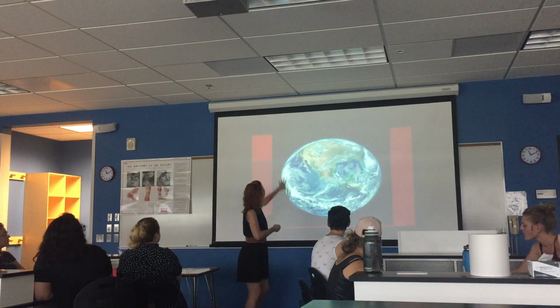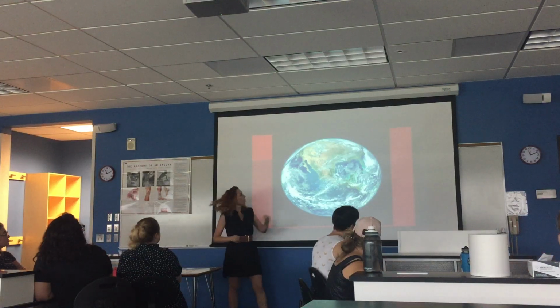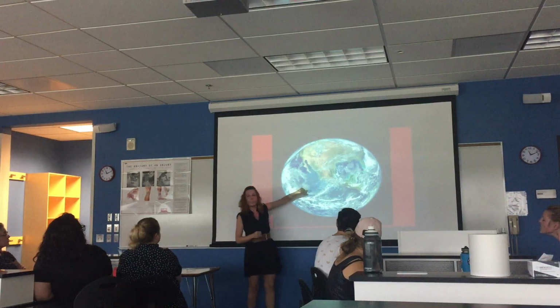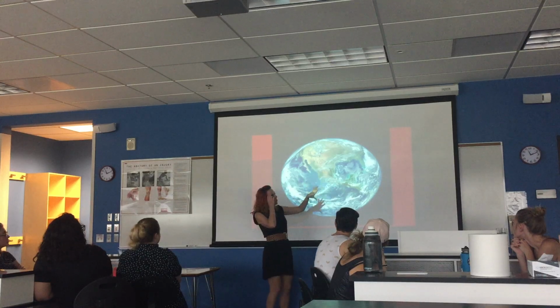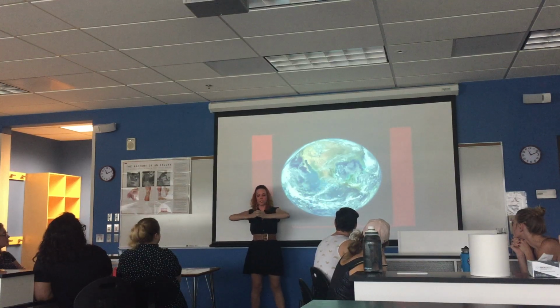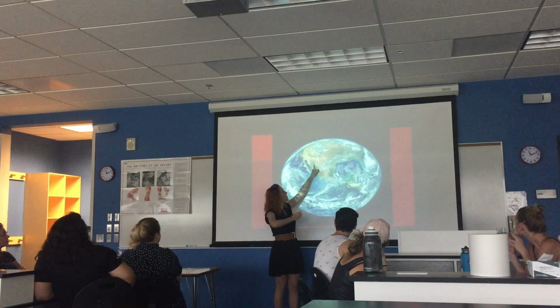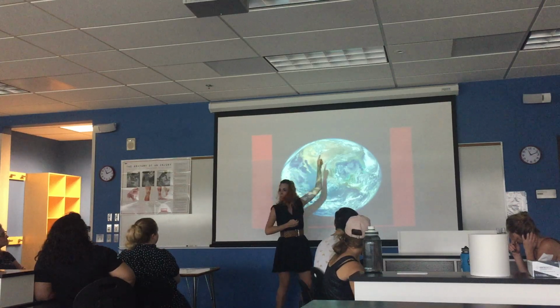Okay, and here's Earth, right? And you were told to go find a tree in the forest. You're not really going to be advised to go looking here in the ocean, right? So always put yourself up at the space station and look at the slide and be like, all right, I think this is maybe where I would find a tree in the forest, right?